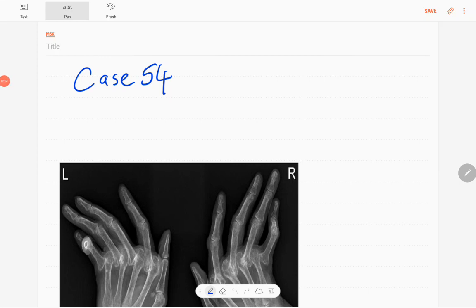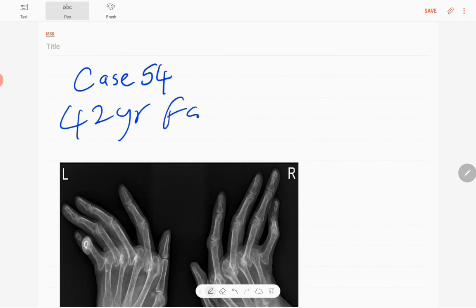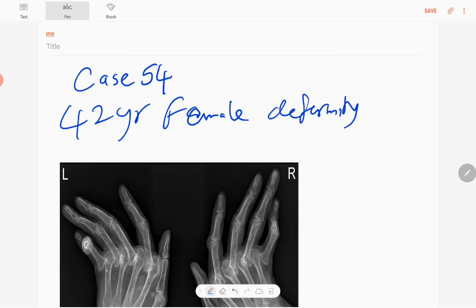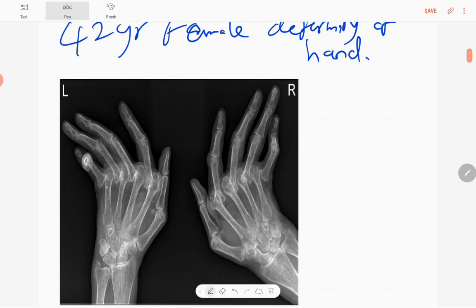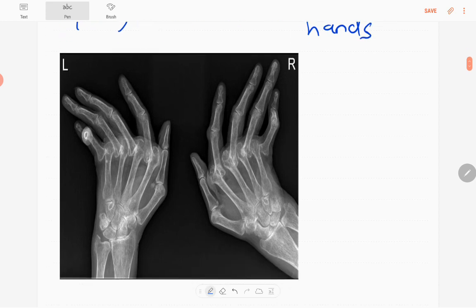Hello everyone, this is case number 54 of the MSK series. Today's patient is a 42-year-old female who presented with deformity of both hands. You can see the anteroposterior radiograph of both hands in a dedicated image of the patient's X-ray.